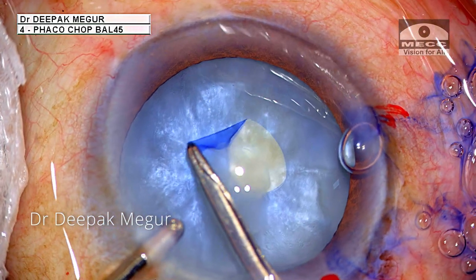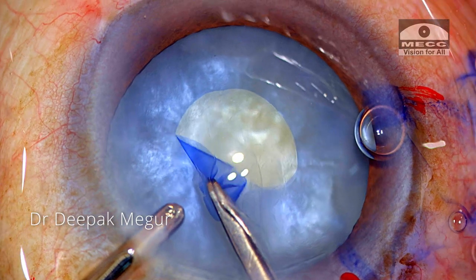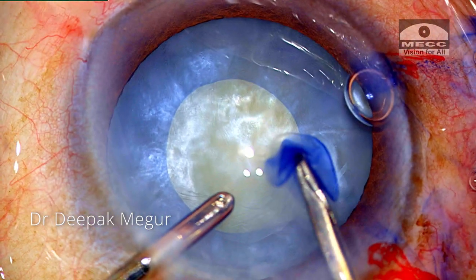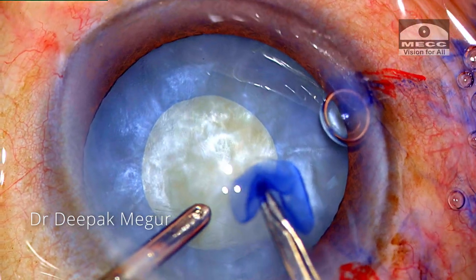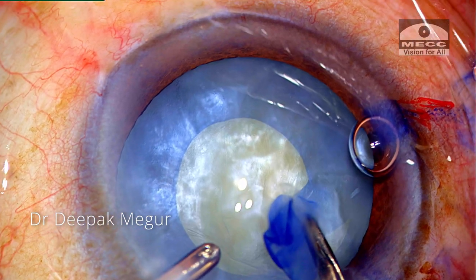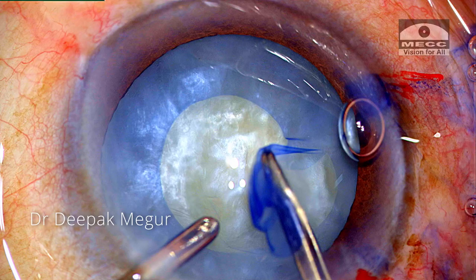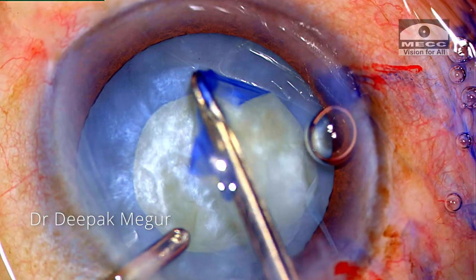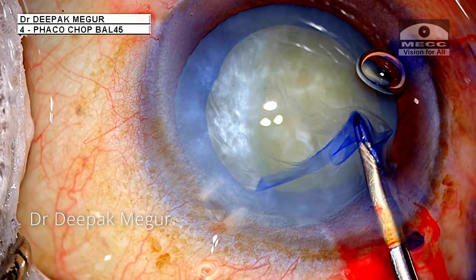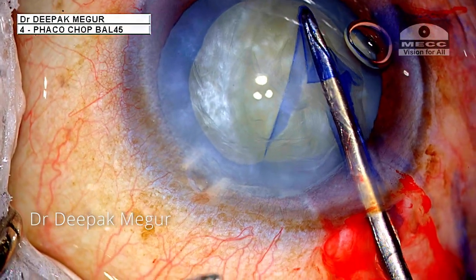Moving on to the last case — I am a little overconfident here. The initial tear is indicating a bigger rhexis to begin with, and so far so good. But at this point it does not look good. Timely recognition and keeping the flap flat, then pulling it centripetally, prevents it from running towards the equator. The whirling technique is then continued to achieve a decent-sized rhexis.